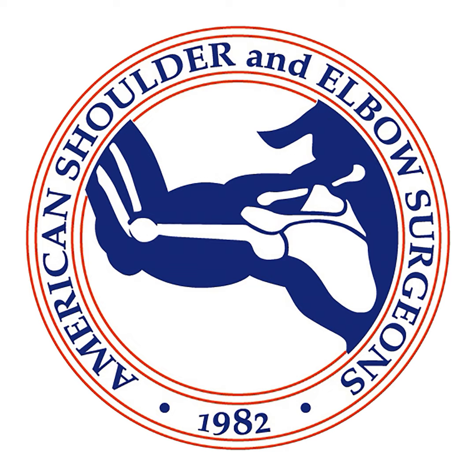So what I've done is, if it's a large patch, meaning there's going to be 3 or 4 medial anchors and I'm going to bridge it over to 3 or 4, I oftentimes will do a mini open approach or just make an open incision, because there's too much suture management and it can be difficult to get the appropriate tension on the native tendon and then get the patch in good position. So in those cases, I'll do an open augmentation.